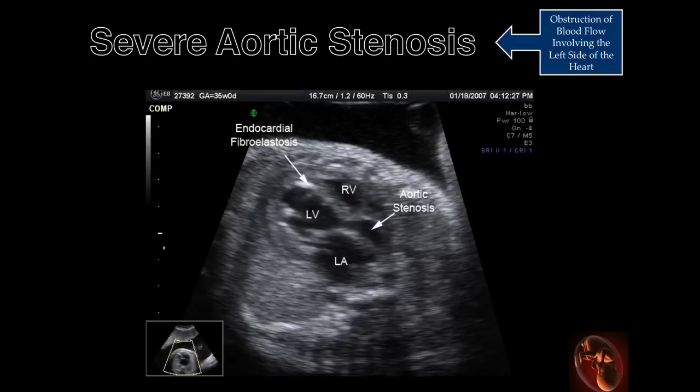For this reason, the examiner reviewing images of the fetal heart should consider reviewing cine clips and not static images.